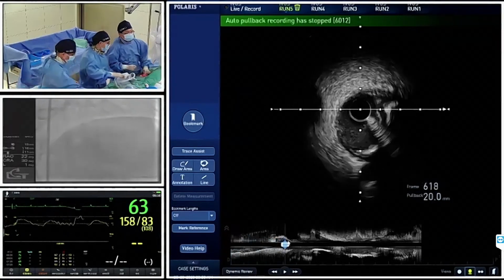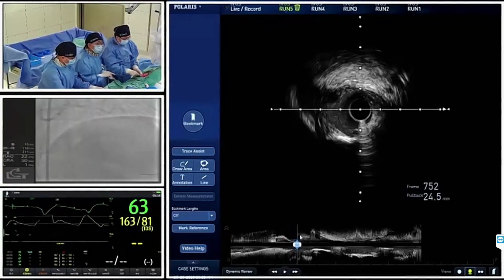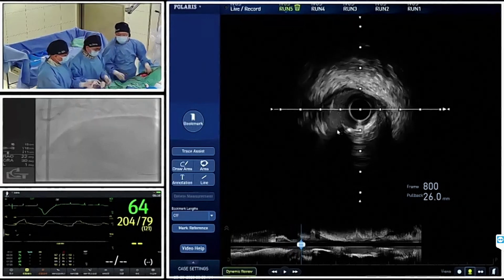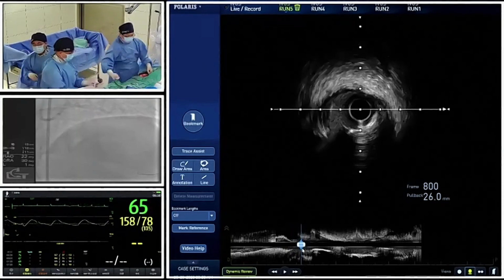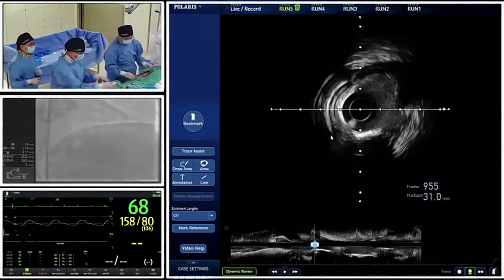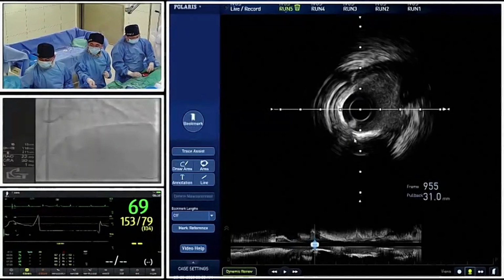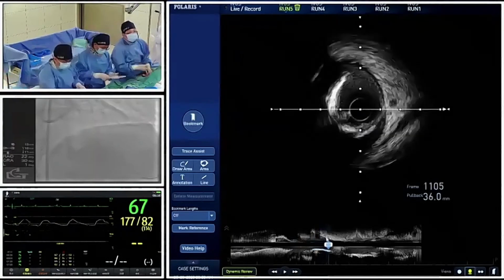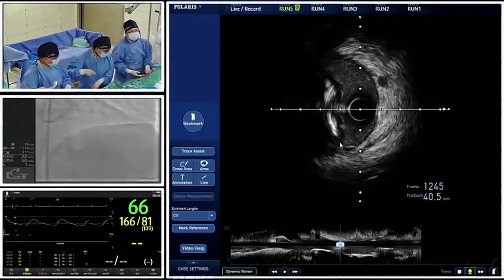For the distal part, the most severe stenosis part, we can see some intima dissection due to the IVL balloon usage. And also here, we can see a very typical, very good sign of calcified crack. Here we can see no hematoma and no big dissections. And also here, good ultrasound reverberation. This is the promise of a good rotational atherectomy, because we make the surface of the plaque very smooth. There is a small dissection at the lateral side because it's a complete calcified sheath.